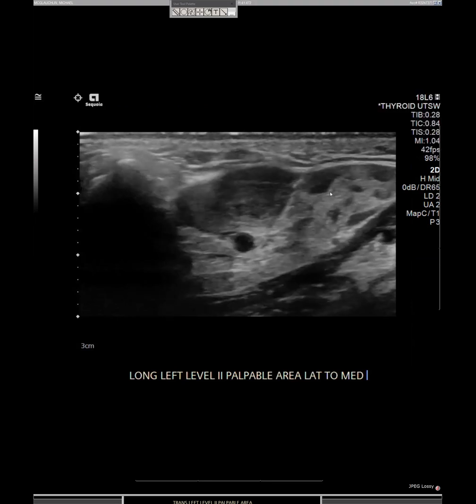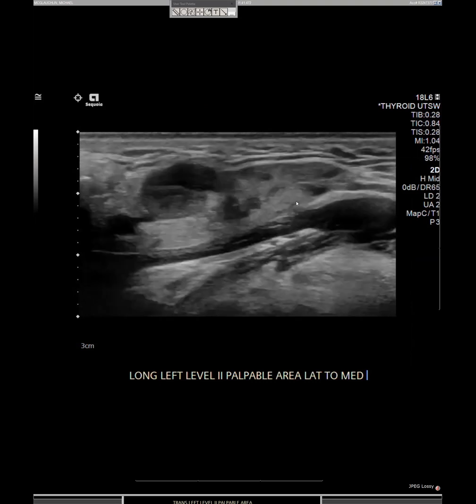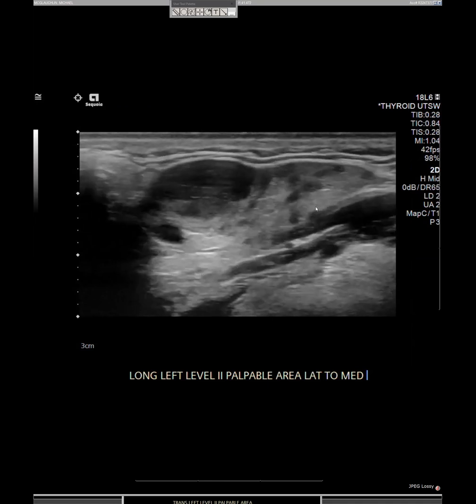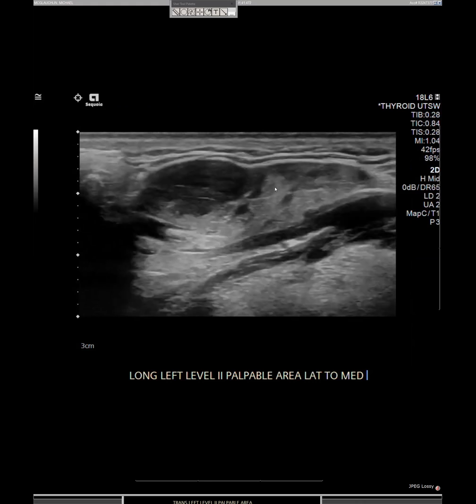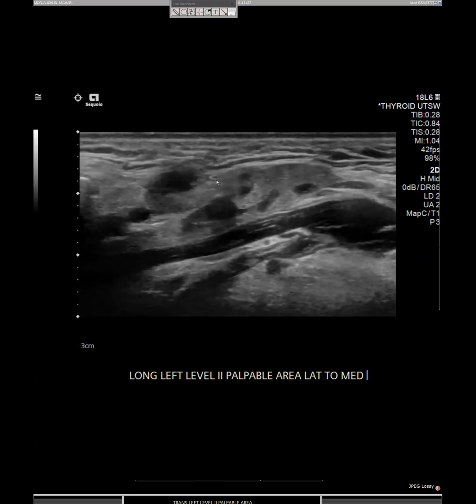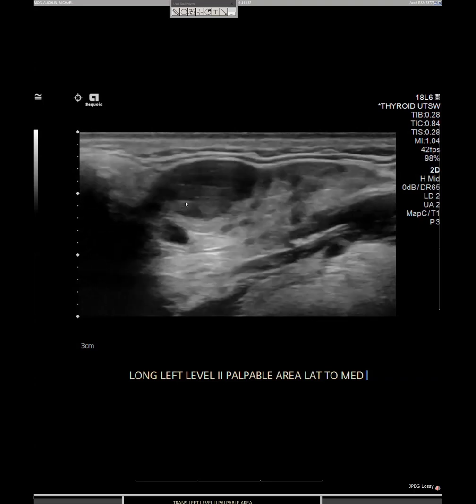Usually we see these little hypoechoic, innumerable, somewhat reticulated-appearing foci in the parotid glands, generally attributed to lymphoepithelial cysts of HIV. Can also be seen in IgG4 and Sjogren's syndrome. And I know our ENT service is always asking us to biopsy these because of the risk of B-cell lymphoma. Unfortunately, usually these things are so tiny we can't get any material out of them. But it just so happened that this one was dominant and was palpable, and we were able to get a core needle in it. So we just had that last week.